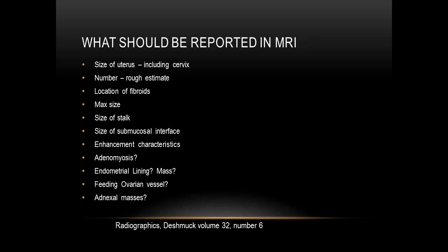In articles that I've read, if there are so many fibroids, it might be very difficult to describe them all. It says to describe maybe the 3 largest. But if any beyond the 3 largest has an abnormal location that would affect therapy and treatment, you should describe those as well.